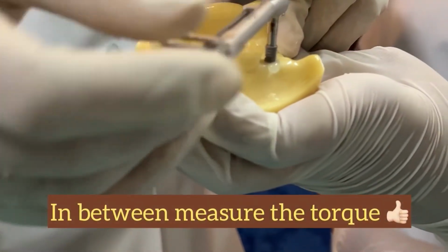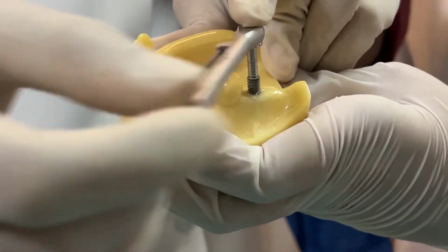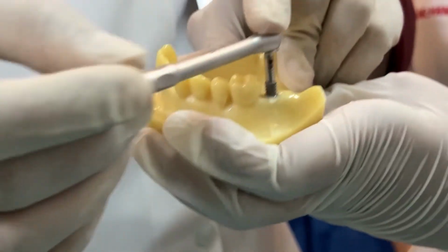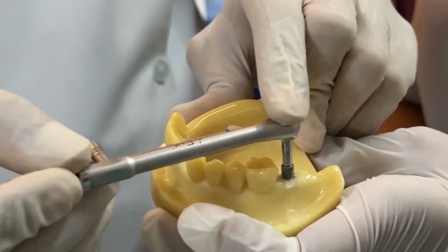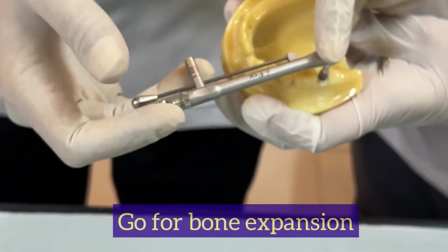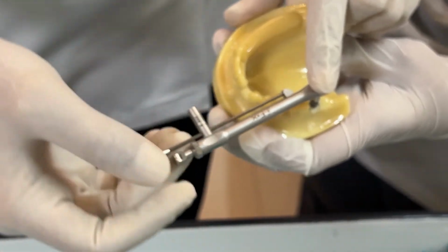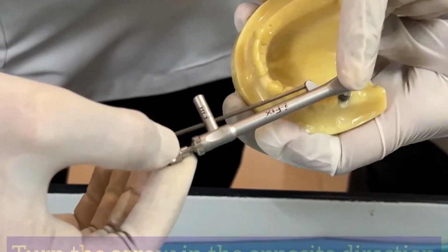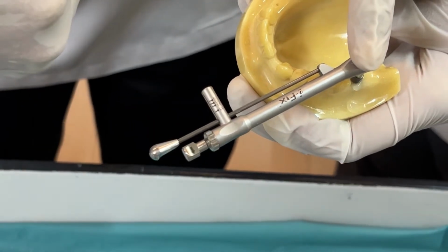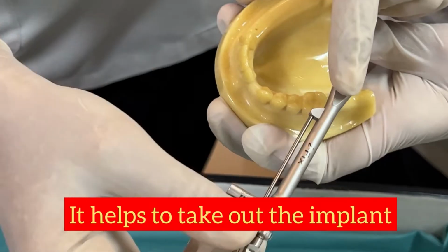In between, what you can do is you can measure the torque with this pin. So the torque is quite less right now. Now you keep on tightening, give it time. Suppose it would have gotten stuck in between, that means the bone is too dense. You can try bone expansion, especially useful in the maxilla. So for bone expansion, what you have to do is you have to turn this arrow around. That arrow which was pointing towards us has been pointed away from us. So what does that mean? Now I am taking out the implant.